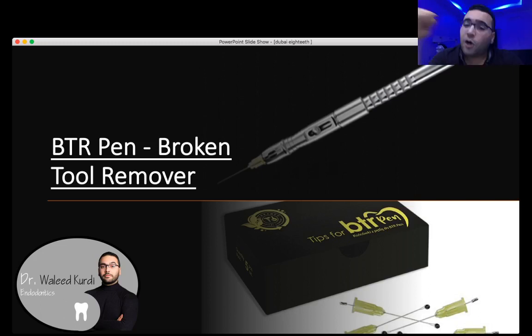So from the ultrasonic technique, I said that I use Ultra X with these great tips. So now if I want to talk about a wire loop technique, I use this BTR pen. This broken tool removal from Cerkamed is a great tool you can use to remove the file.